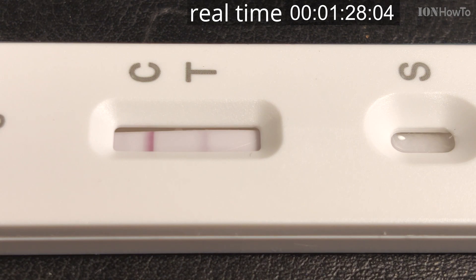This is in real time — you can see that after about one and a half minutes, the T line starts to show a little bit.